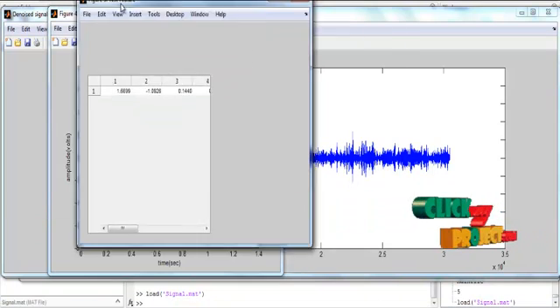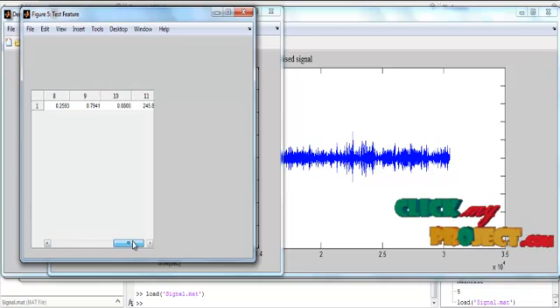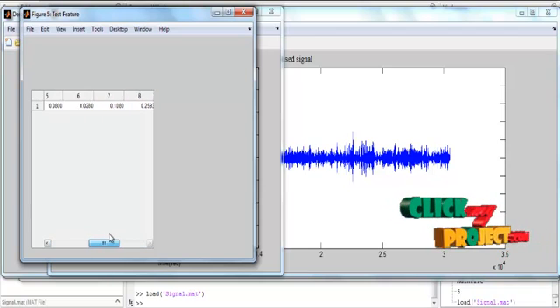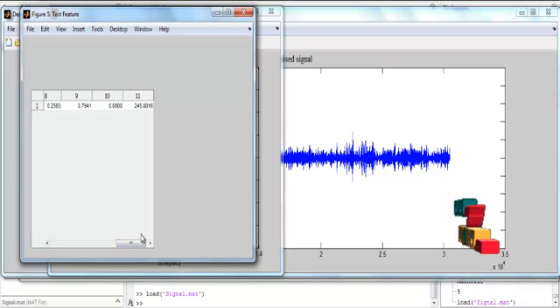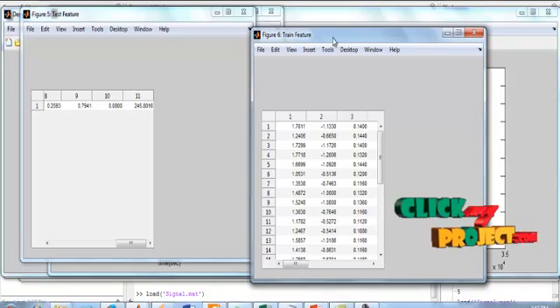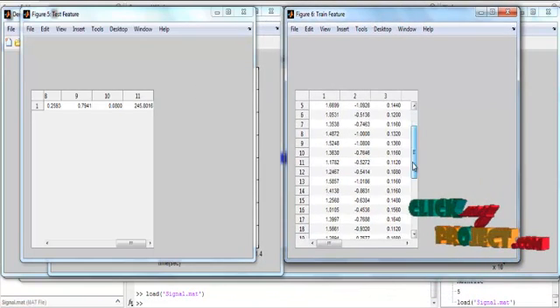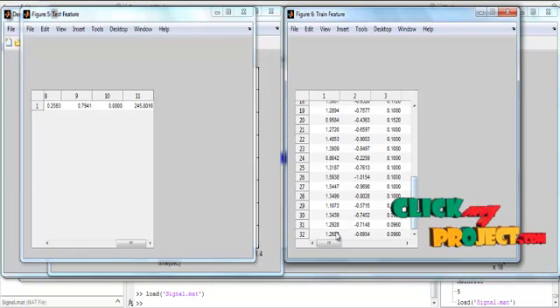Then the test feature values are shown in the table. These are the test feature values extracted from the signals. This is the features for the train values. The train values consist of 32 signal features.